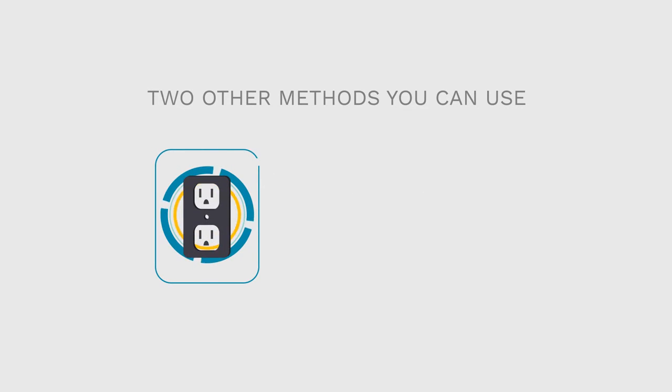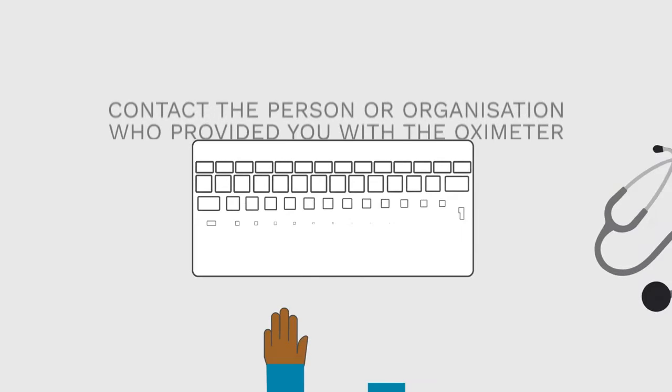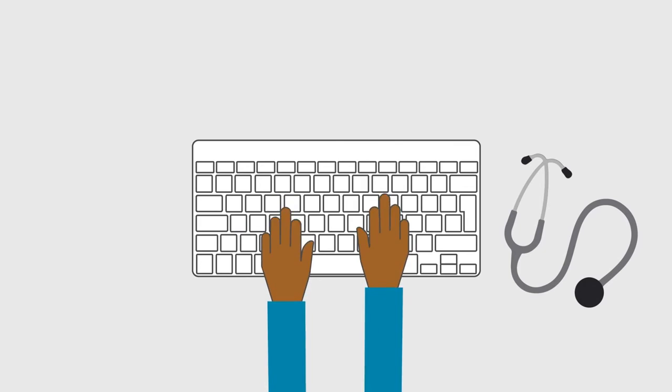You can also use the oximeter directly from the mains electricity. If you're going to use this method on a long-term basis, remove the rechargeable battery so that you do not cause the oximeter to overheat. If your rechargeable battery stops working, contact the person or organization who provided you with the oximeter, or contact Lifebox directly.